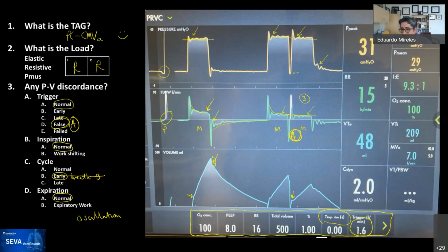So when I set the respiratory rate, I'm thinking, well, what's the minimum minute ventilation that this patient can live with, and that he would be able to trigger above that on its own. So allowing permissive hypercapnia as much as you can, and allowing the patient to exhale as much as possible. The fellows say use bronchodilators, consider decreasing the volume too if acid-base gas exchange is okay. They also said suction the patient if needed. And yeah, all of those are appropriate treatments.